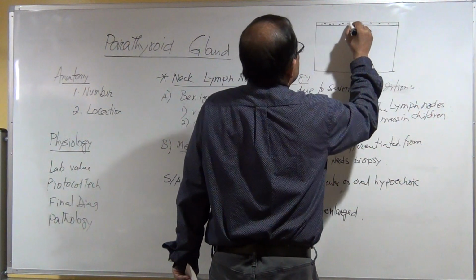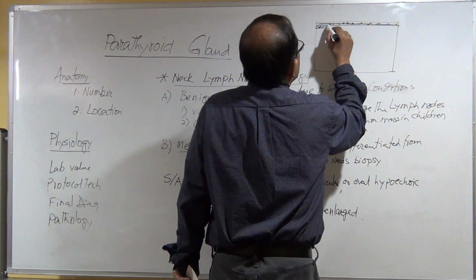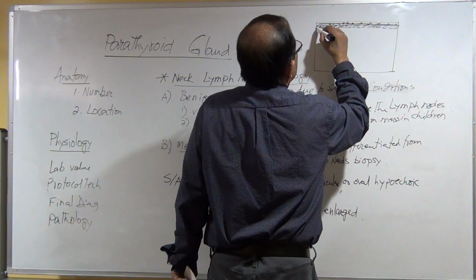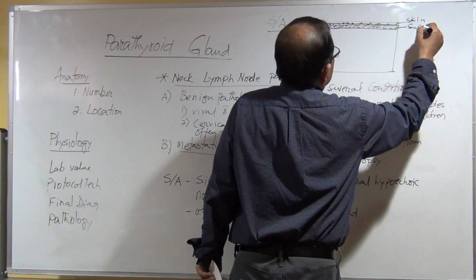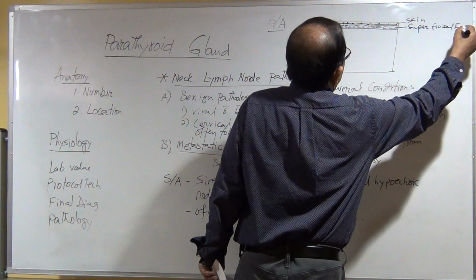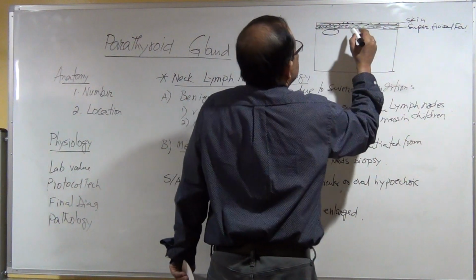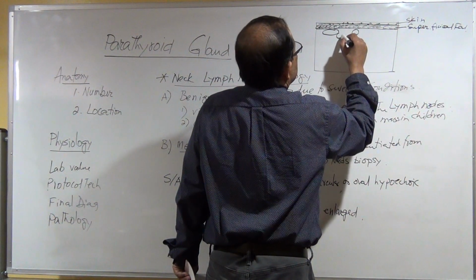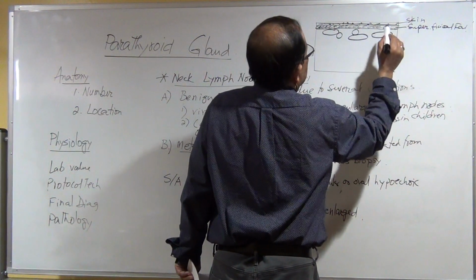When you see the multiple lymph nodes, so these are the skin, this is the skin, and there will be hypoechoic, a little fat. So this is skin, this is superficial fat, then you will see oval shaped or circular. Sometimes you will see it is attached. Sometimes you will see it is isolated.